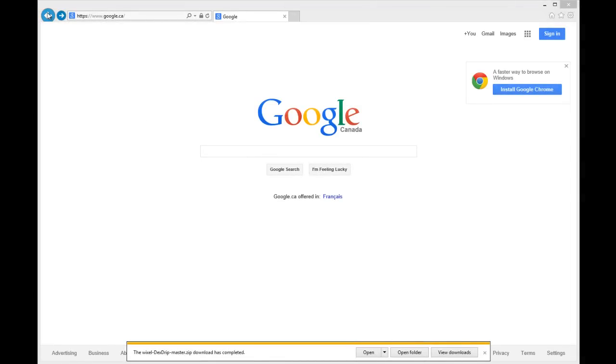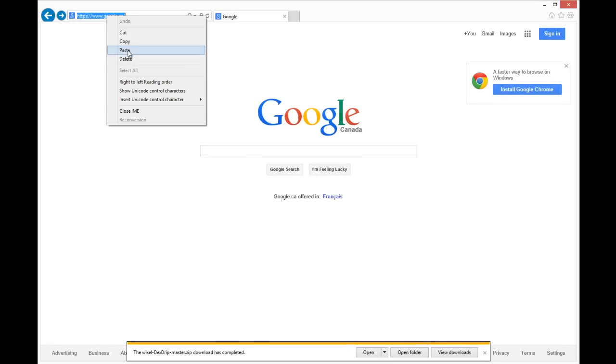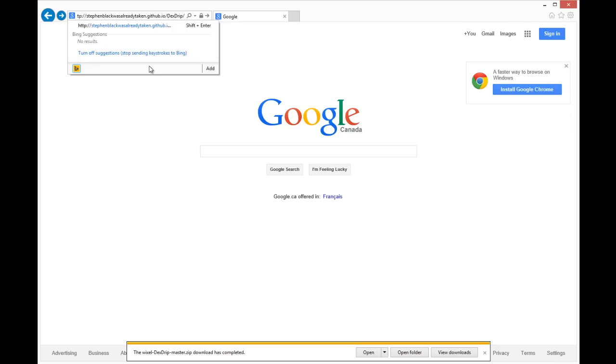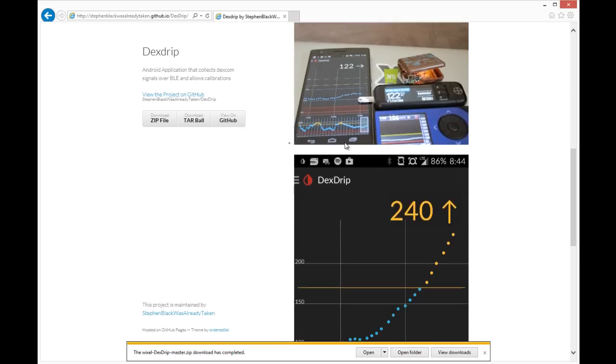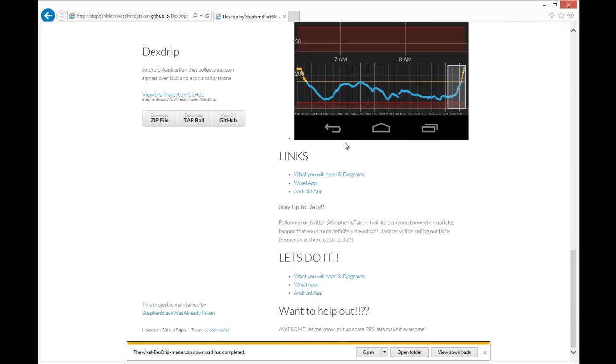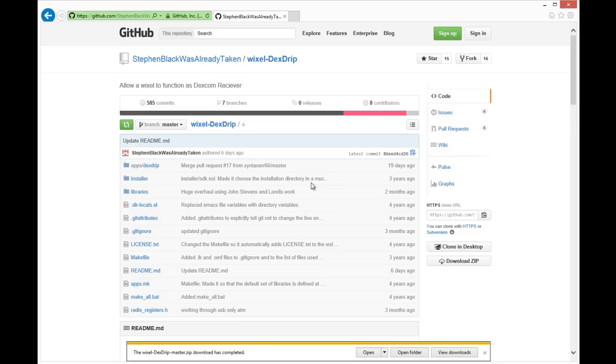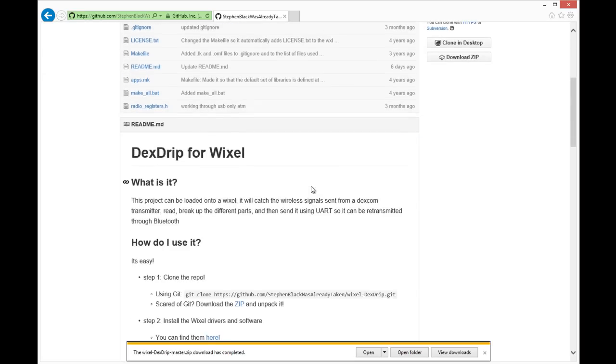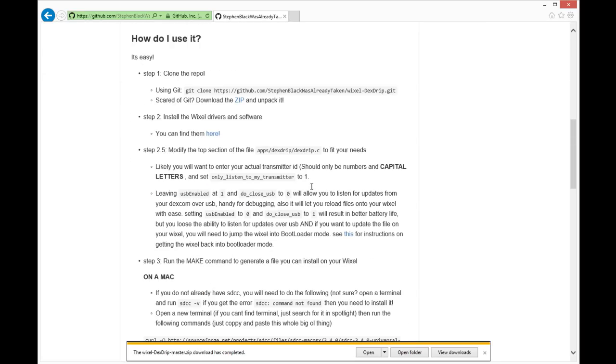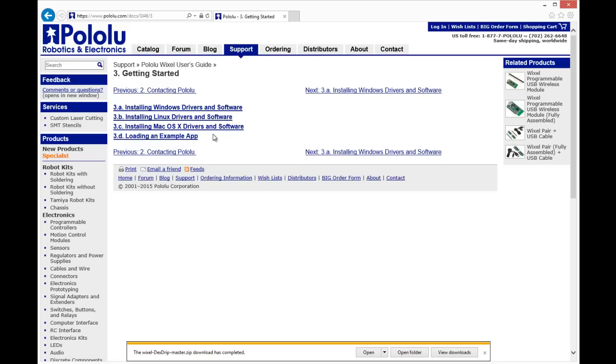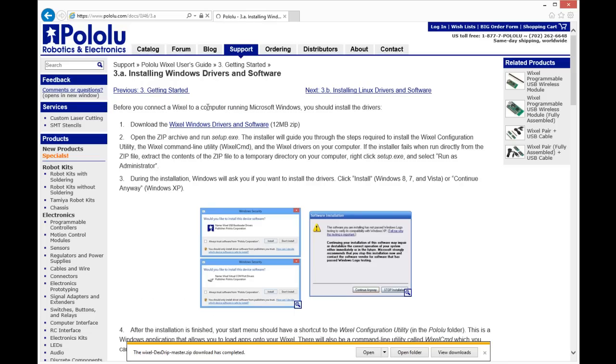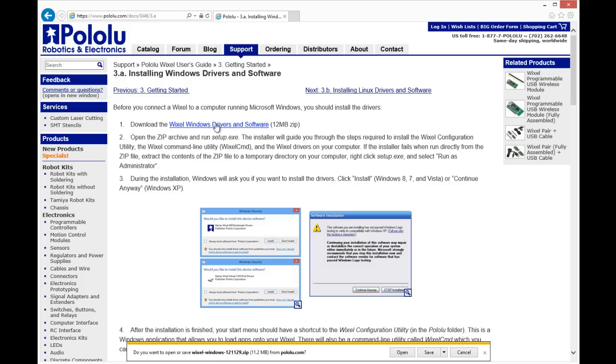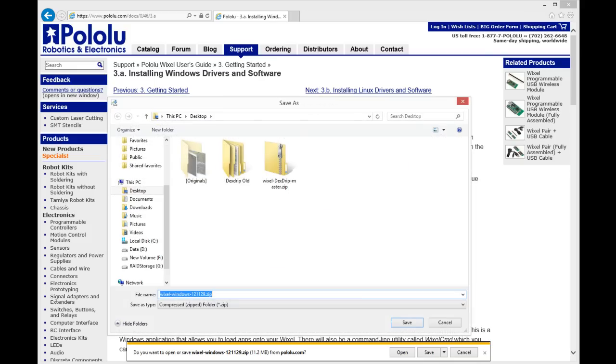Once you have it extracted, the next thing we're going to do is download the Wixel drivers and the software. And there's the link to it right there. That'll take us to the site where we got the Wixel with instructions on how to install the Windows drivers and the software. So we'll just save that to the desktop.